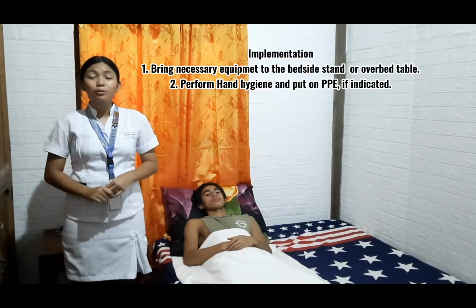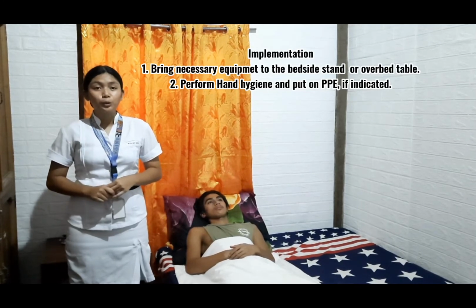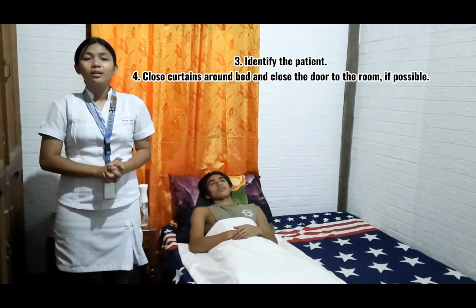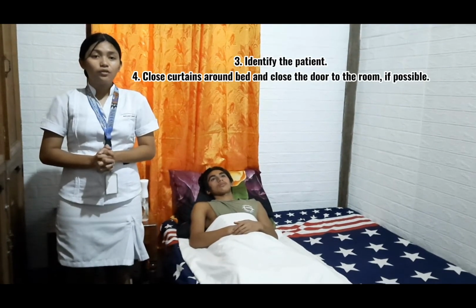For the implementation, number 1, we need to bring necessary equipment to the bedside, stand or overbed table. Number 2, we need to perform hand hygiene and put on PPE if indicated. And then next, we need to identify the patient. Next, we need to close curtains around the bed and close the door to the room if possible.